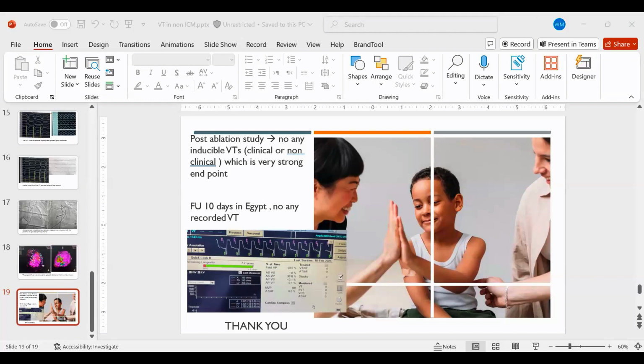Okay, great. Dr. Ashley Shin, do you have any comment before our closure? We also have Dr. David Bradley on board. Oh, great. No, it's a very good case. I just wanted to ask you, when you mapped the epicardium, I know you did a nice pace map and you matched close to 12 out of 12. Did you do entrainment mapping as well, or did you just go for the exit sites? No, we did not do entrainment because the tachycardia was unmappable due to hemodynamic compromise. So we just depended on the late potential mapping and the perfect pace match at the exit site.